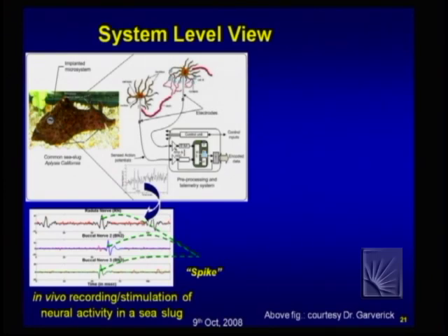So, if you can put a set of electrodes in the ganglia of aplysia, one can monitor the extracellular signals, and those signals can be analyzed by signal processing units, and of course, it has to be preconditioned by analog hardware. So, the idea of using this implantable digital signal processing unit is to identify the spikes, and the spikes correspond to neural activity.